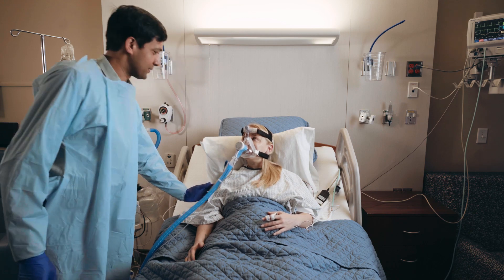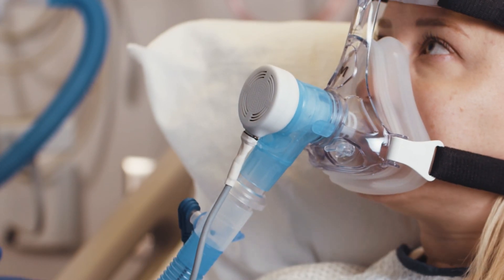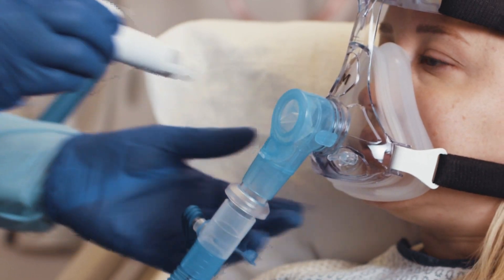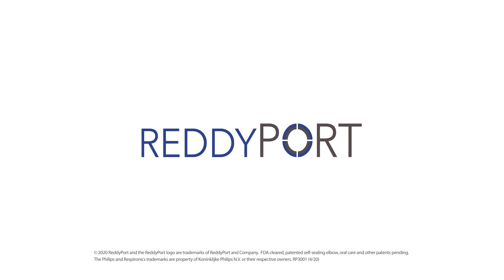When the patient is finished talking, turn off the ReddyPort controller and unplug the connector side of the cable from the microphone. After the cable is unplugged, remove the microphone from the elbow and place it somewhere safe from contamination. Thank you for taking the time to learn more about ReddyPort non-invasive ventilation products.